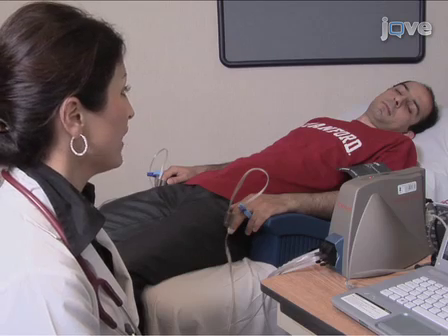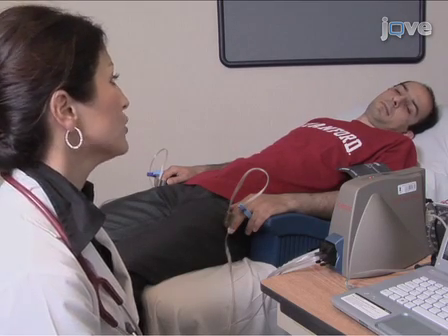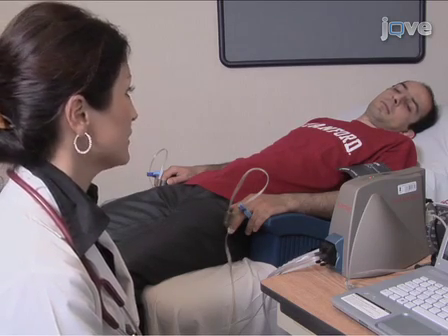We are going to inflate the cuff for the occlusion phase. Please, you should stay relaxed and please don't move your fingers. Thank you.